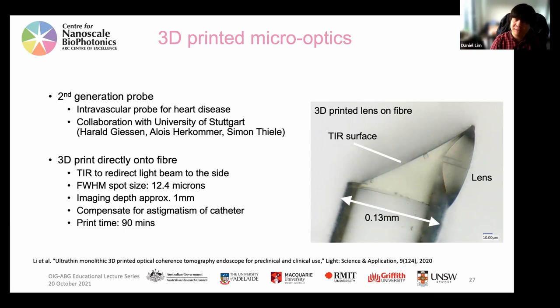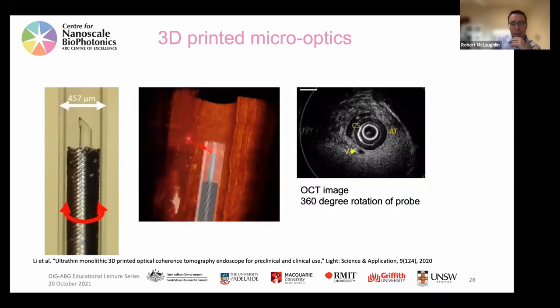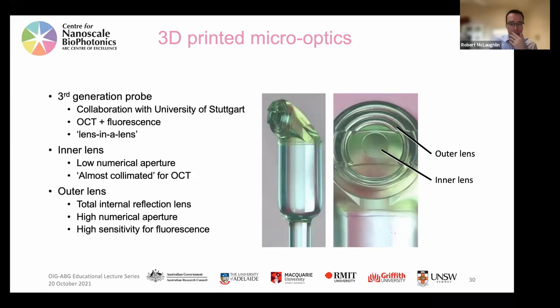And for the lenses, is that something that you also design in terms of the optics of how it converges? Yep, and I think the most recent one is a real example of where you can get quite involved in those designs. For us, the exciting thing about 3D printing is we've got so much control that we can 3D print shapes that are really customized to lots of different aspects of optics. So we do a lot of work, especially with our colleagues in Stuttgart, in the detailed design of what these are. With 3D printing, we can suddenly fabricate these crazy shapes. Interesting. Thanks.